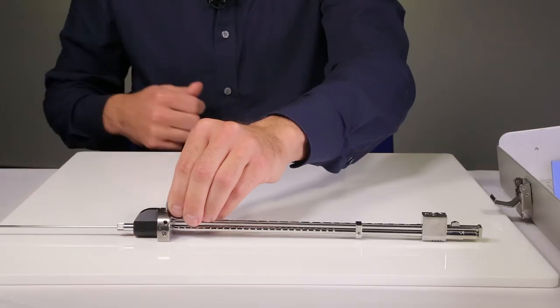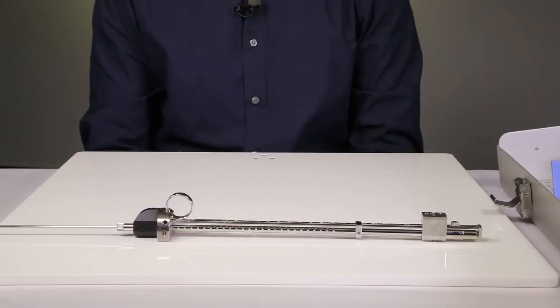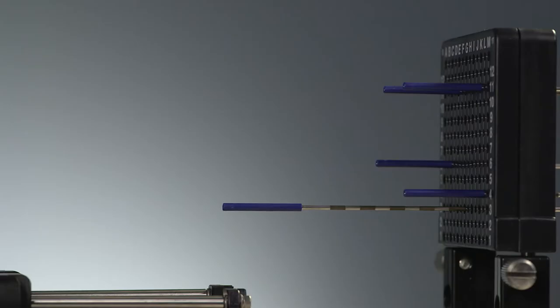The reverse must be carried out to dismantle the applicator for sterilization. Next, I would like to show you the use of the applicator for an implantation.